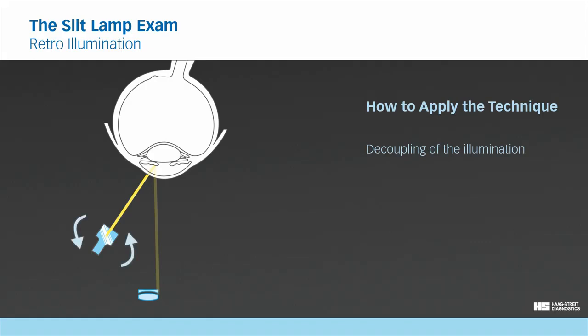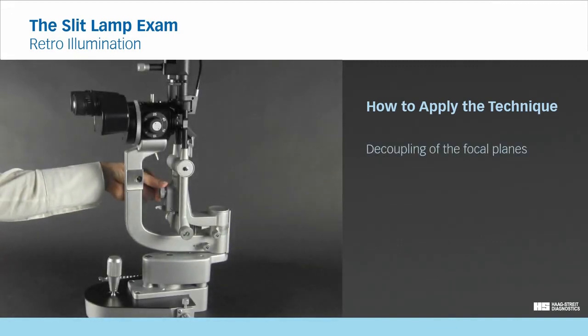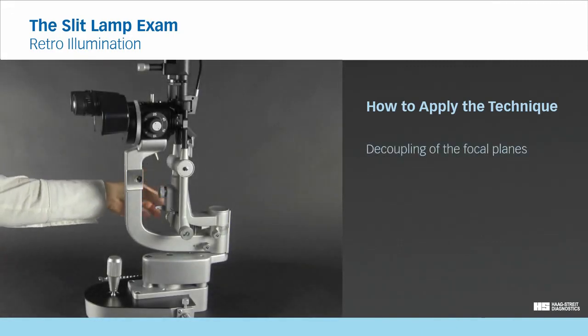By decoupling the illumination from the microscope, you change the focus point of the illumination, and thus bring the retroilluminated area back into your field of view. This can be done by loosening the decoupling knob and rotating the illumination tower.